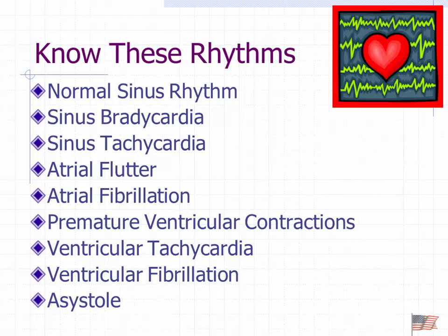So, for the exam, what I want you to know are these tracings. Normal sinus rhythm, that should be a gimme. Heart rate 60 to 100 beats per minute. P wave, QRS complex, everything looks normal. Sinus brady, it's just slow. Sinus tachy, it's just fast. Flutter's got the sawtooth. Fib's got the underlying baseline that looks ugly and is usually irregular. Irregular, because there is a rhythm that is regularly irregular, but we won't talk about that yet. It's one of the blocks.